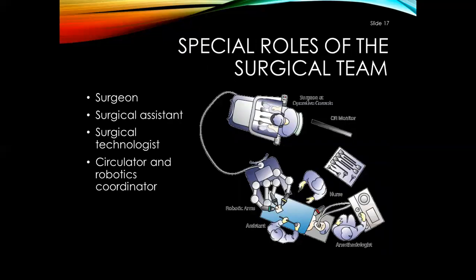Then there are some special roles of the surgical team. Components need to be positioned in a way that optimizes safety and communication among team members. So that's a big role for everybody, okay? Surgeon, surgical assistant, surgical tech, circulator, and robotics coordinator.